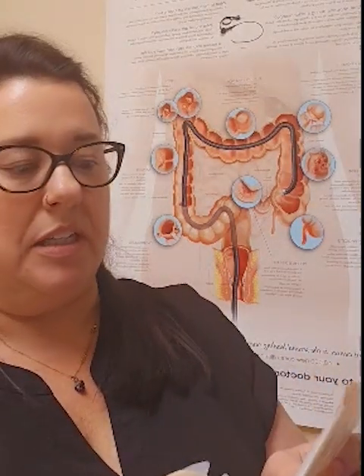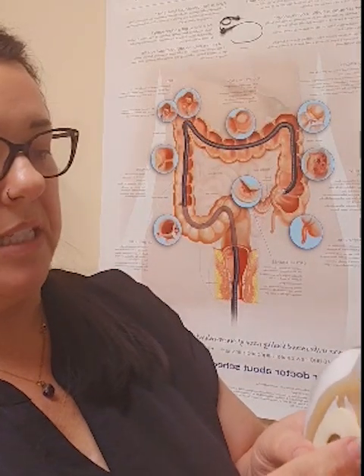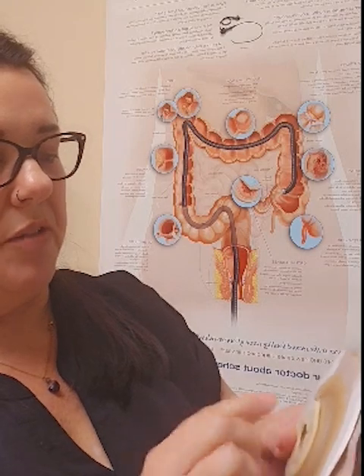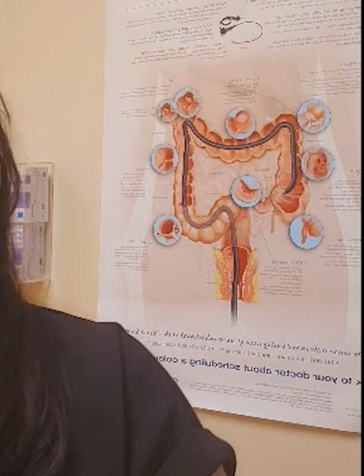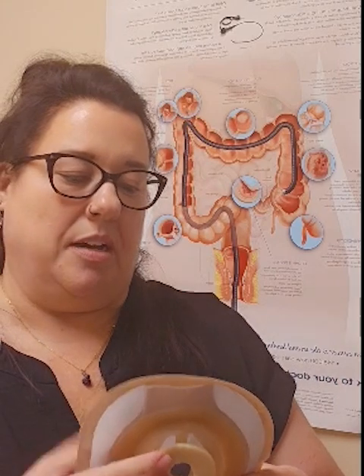For an ileostomy bag, a strip paste or molding ring is a great way to help build up around the base of the stoma and protect the skin around the ileostomy. Colostomies are different because the stool consistency is different. However, it's not a bad idea to use a strip paste or a molding ring anytime when applying your appliance.